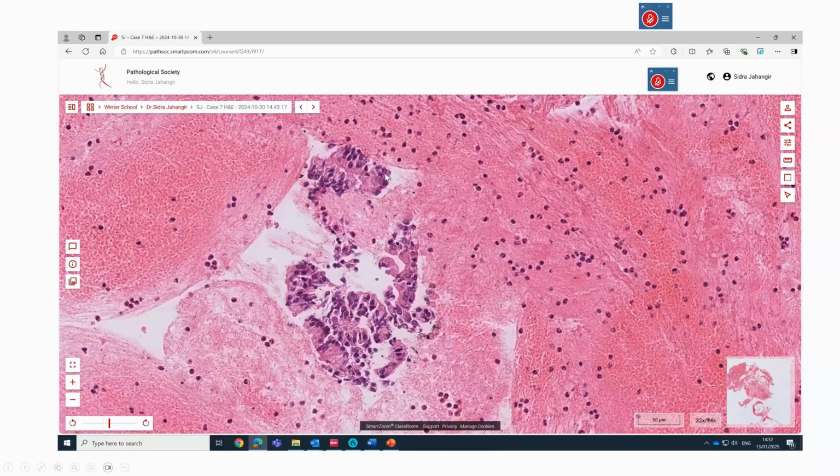And we got some tiny material from the same material in the cell block and PAP slide. Diff-Quik stain or the Giemsa stain is best to assess the architecture. Architecture assessment is equally important in cytological preparations and for on-site adequacy. But to assess the nuclear features, PAP stain is the best stain.